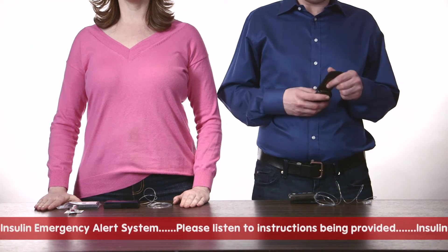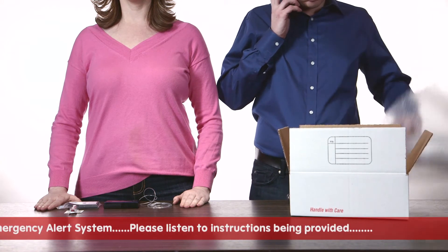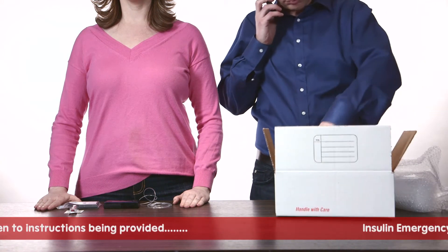Then find a box, approximately 12 inches of bubble wrap, tape, scissors, a vial of insulin, and your backup insulin syringe.